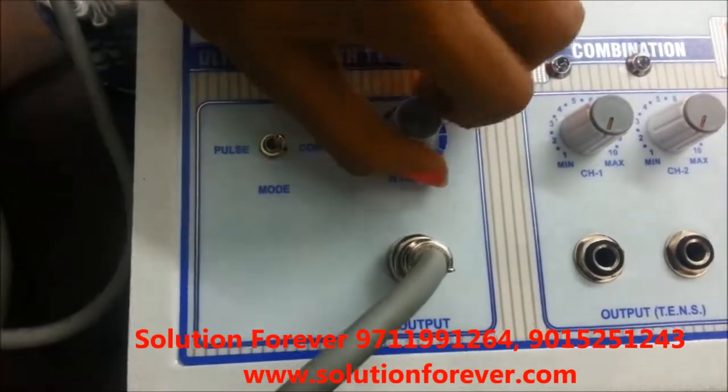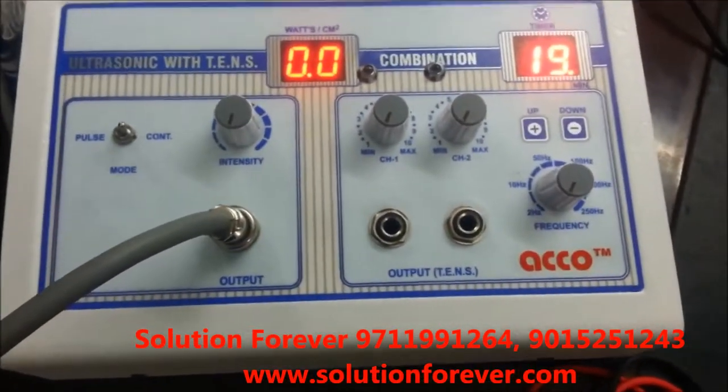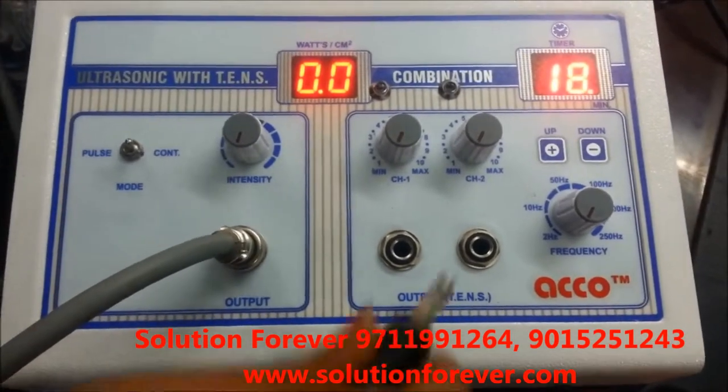After treatment is completed, make intensity knob at zero. Now we will show you the demo of Tense Unit. Attach leads and wire.